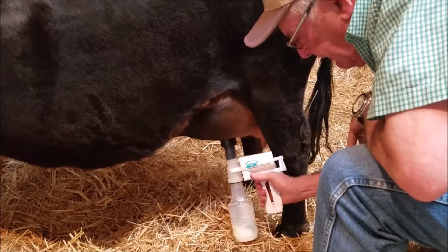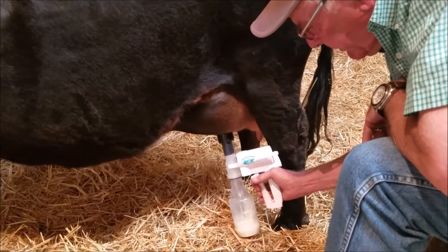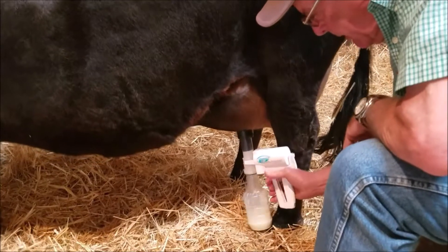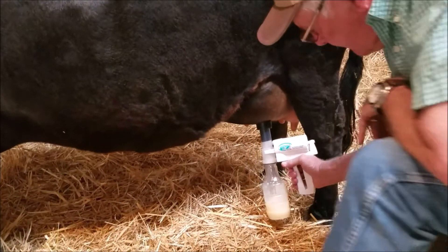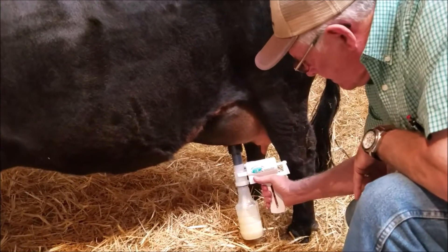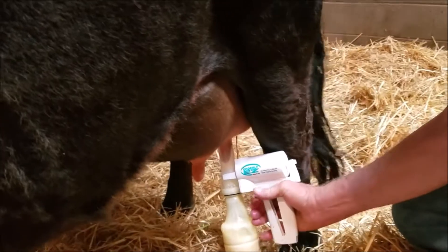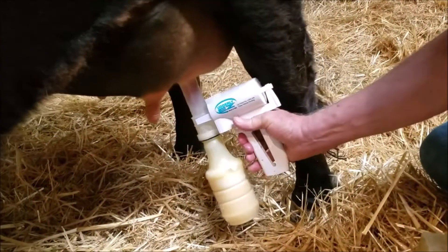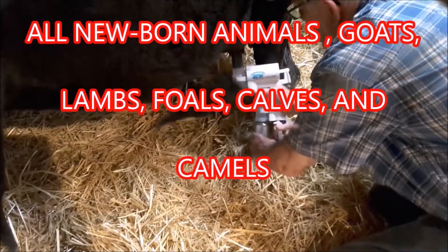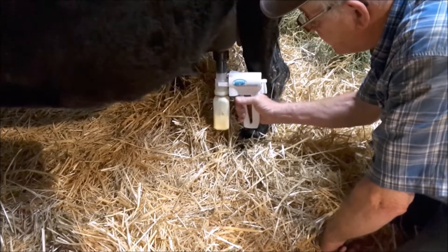Once you get the vacuum set, just quit pumping. When the flow goes down you can give it a couple more pumps and pick it back up. Colostrum is going in there — I'm pulling colostrum. This calf was just born a half an hour ago.